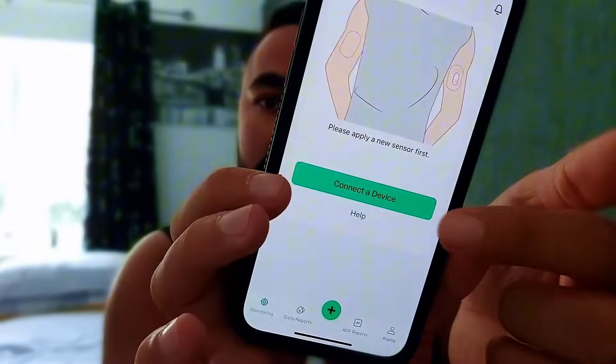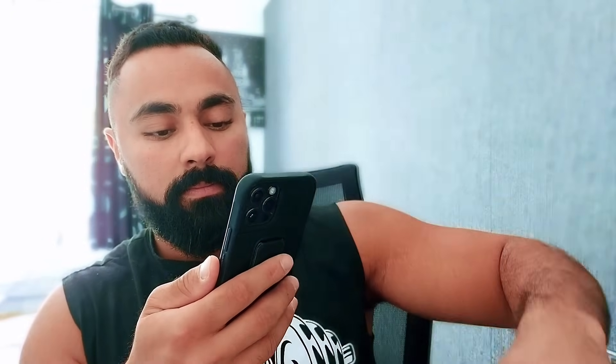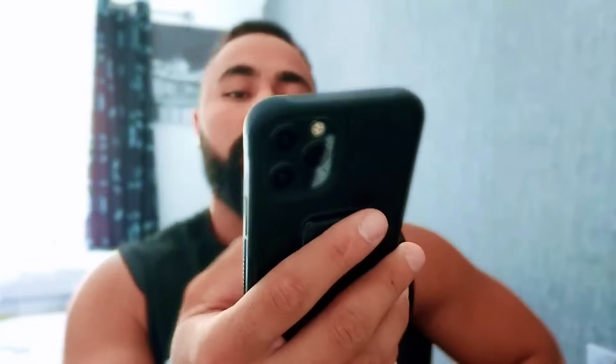Then all you need to do is take your phone, go to the app, click 'Connect Device,' go to the QR code on the box, and just scan it. Here we go — we just scanned it, it's loading. That's it: 59 minutes till it works.